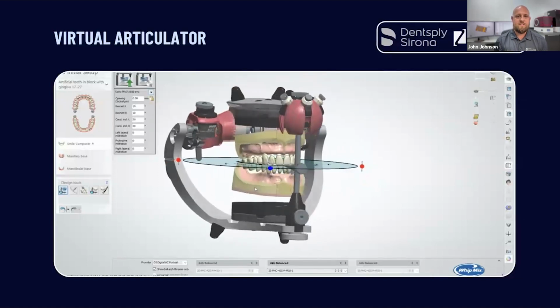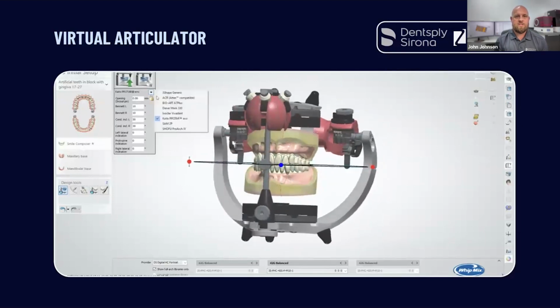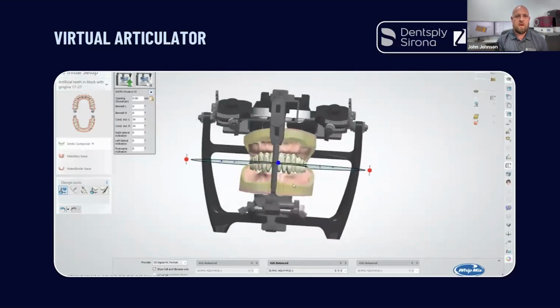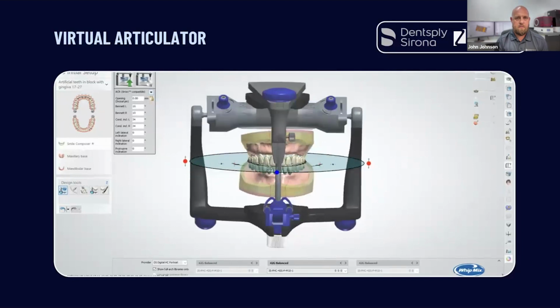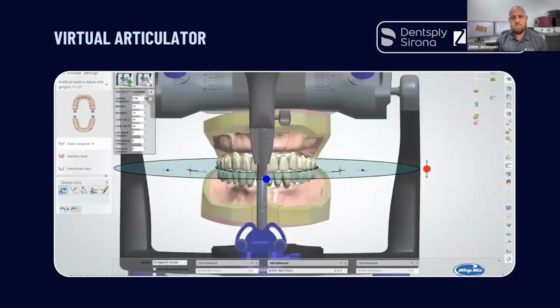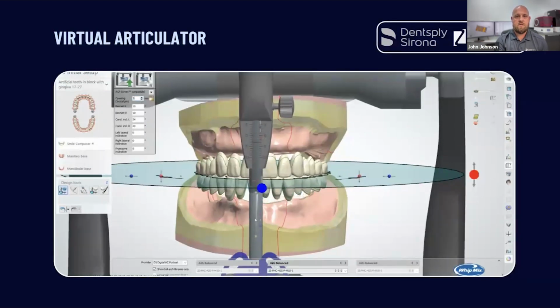This is me showing you there's an array of articulator options, whatever you're used to, and you can make those digital adjustments anywhere. You can make all those Bennett moves, the condylar guidance. You can make all those adjustments. You can also open and close the articulator. I'm not sure if it actually showed that part yet. But that's exactly how I would mount the case in the physical world, and that's how it sets in the digital world. And that's showing you right there where you could open the articulator.